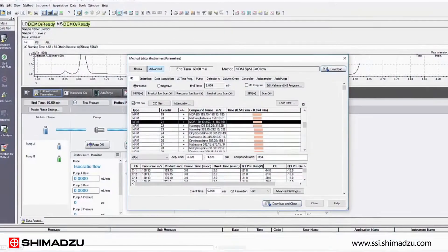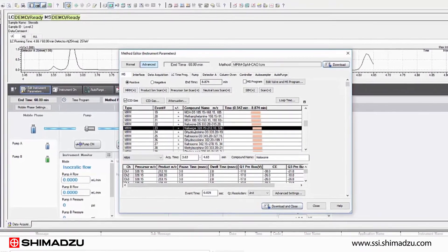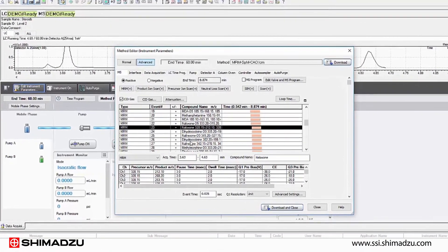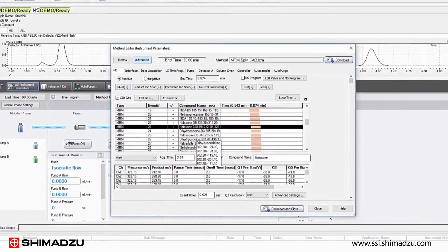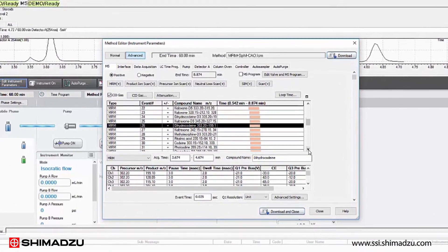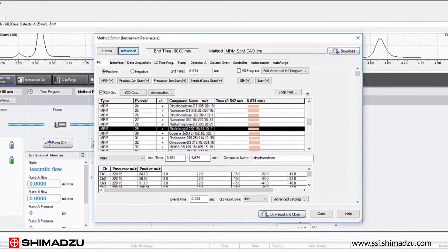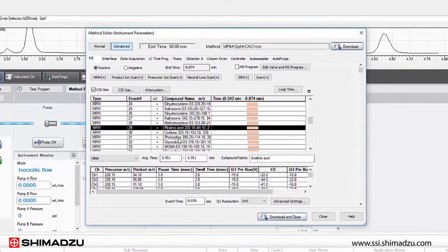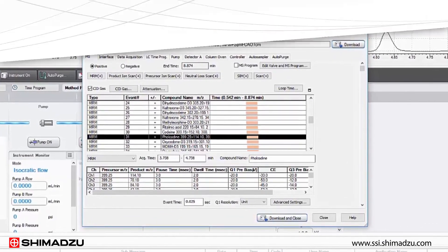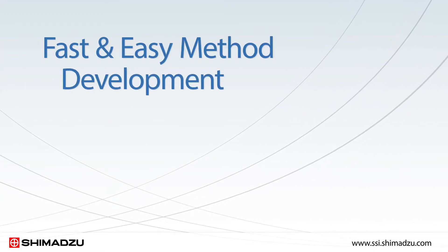This feature, which is called MRM spectrum mode, acquires all compound fragments of interest in MRM mode and can be used to create accurate spectra from even trace concentrations.